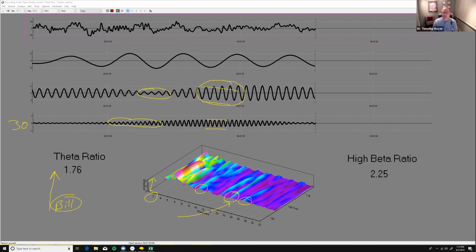And it's those representations of height and valley that start to act as the biomarker for different things that people experience. So let's take a look at mine. We're going to run this for a second. And I'm going to transfer these into a graph that you're going to be able to understand in a second. And that will segue us into our discussion of biomarkers.